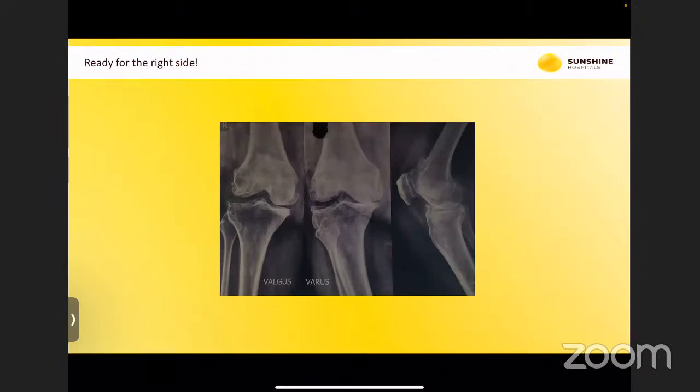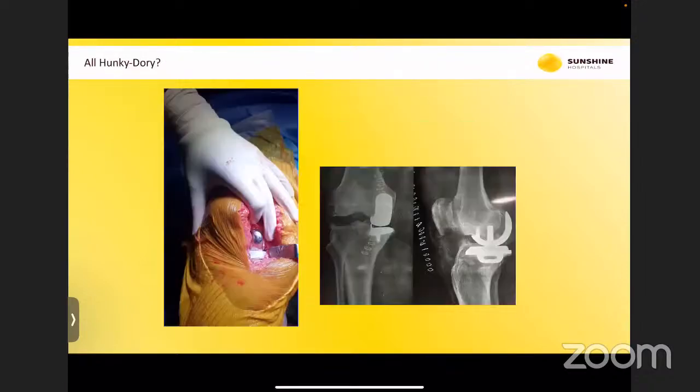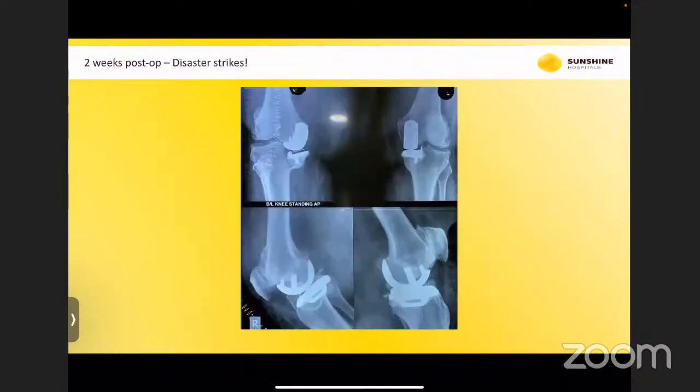So let's see a few complications that I've had in my practice. This patient had proper bone-on-bone arthritis, you can see over here, and no reduction in the lateral joint space. So we went ahead and did a uni. She was a pretty obese lady and it looked all good. Then after 2 weeks, disaster strikes. She came back with a lot of pain, and we found that she had a medial condyle fracture 2 weeks later. The other side was doing very well, but this side she had a big fracture.